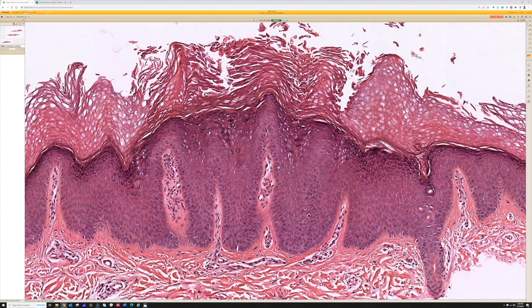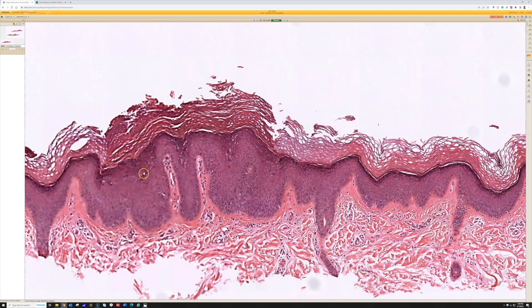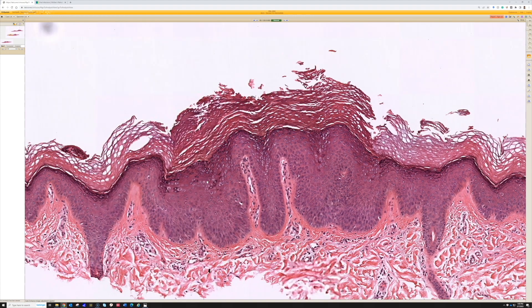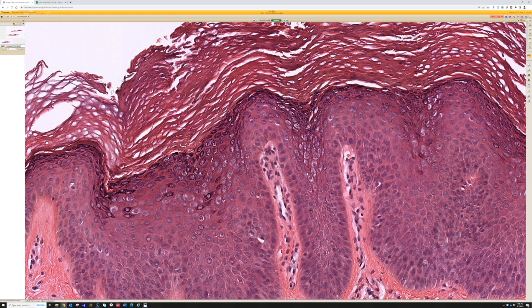Here we have one lesion of verruca plana, and over here we have more normal epidermis and then another verruca plana — and the bird's eye coilocytes are even better here. Verruca plana are often present as multiple lesions, either grouped together or in a linear fashion along a site of previous excoriation or trauma. For example, people who shave with a razor blade can track the virus along the skin at areas where the razor damages the skin.